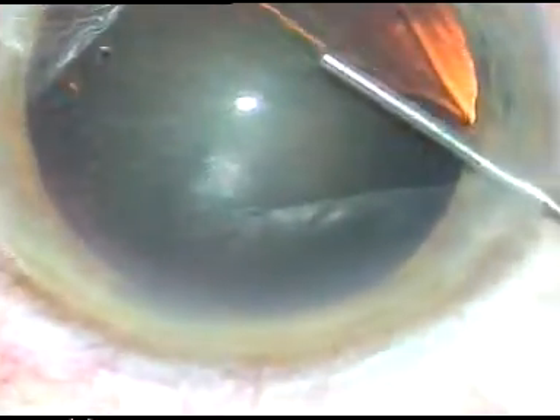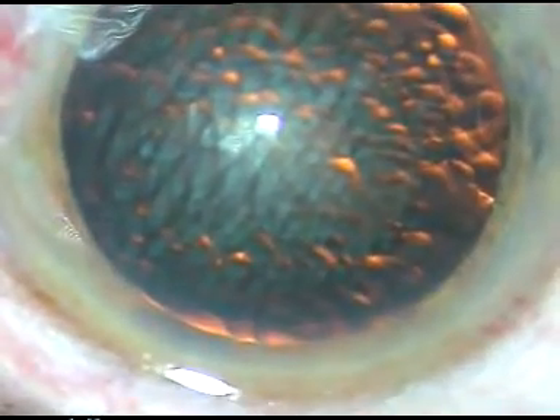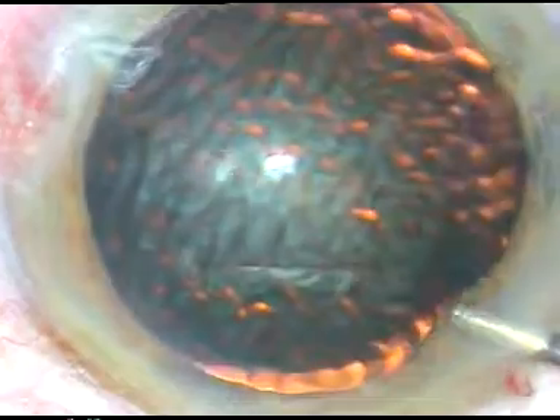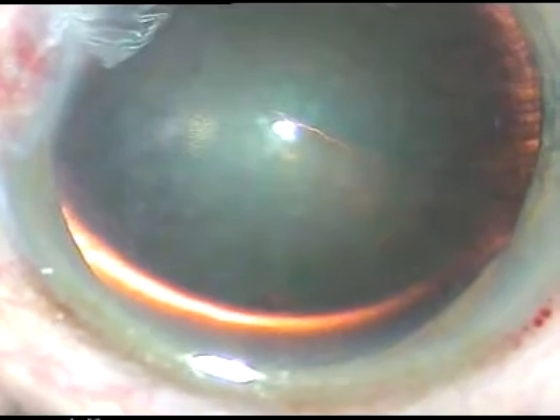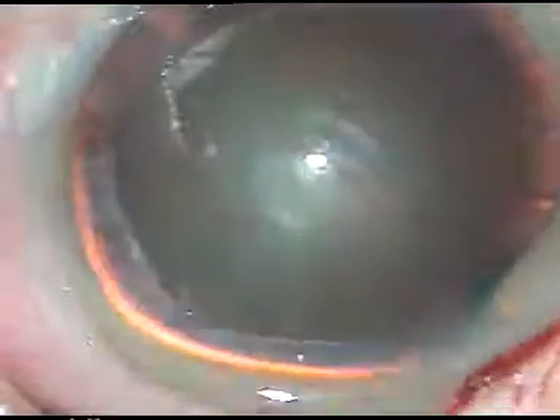Now we are going to use Viscoat. I am going to use an adequate amount of it. I am injecting HPMC just over the anterior capsule — this HPMC pushes the Viscoat upward, and the Viscoat sticks to the corneal endothelium, giving very good protection of the corneal endothelium.